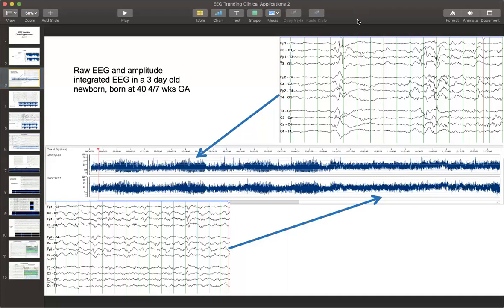Let's see. Looks like... I just also put a chat message. I should have reminded people that the first part of your talk on EEG is actually applying a moving average to the EEG, just such as people often do when they look at their stocks, as a matter of fact, or the coronavirus.